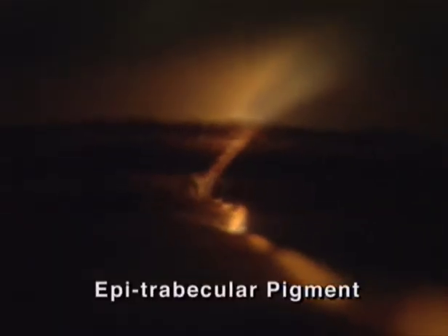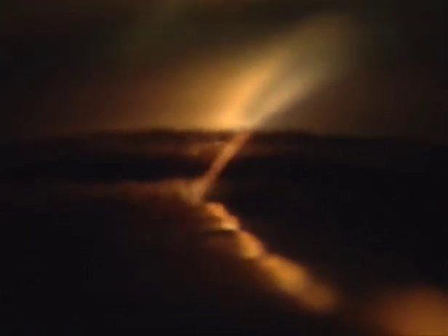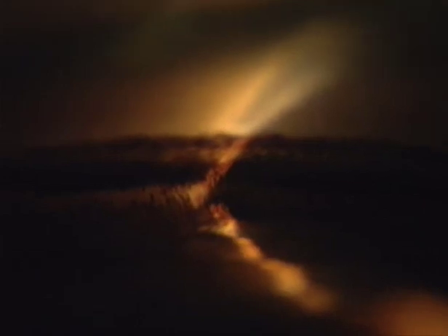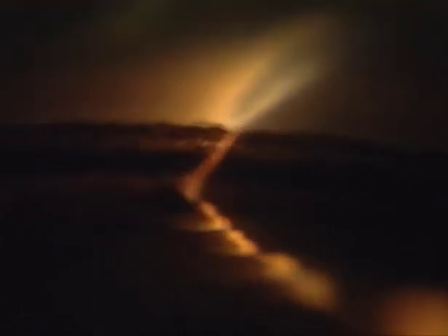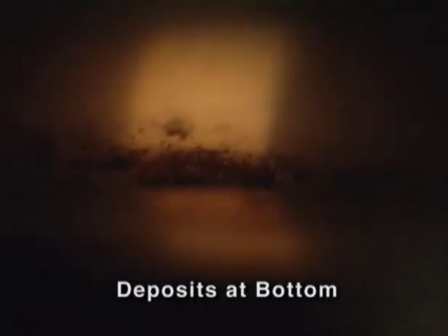Endotrabecular pigment forms patches within the meshwork in the area of Schlemm's canal. Epitrabecular pigment may also accumulate in Schlemm's area, and often has a superficial relief, which can be made out in optical section. Furthermore, superficial pigment may accumulate at the meshwork adjacent to Schwalbe's ring. In contrast, deposits at the bottom do not respect anatomical boundaries and may spread over the scleral spur as well as over the ciliary body band and the iris root.